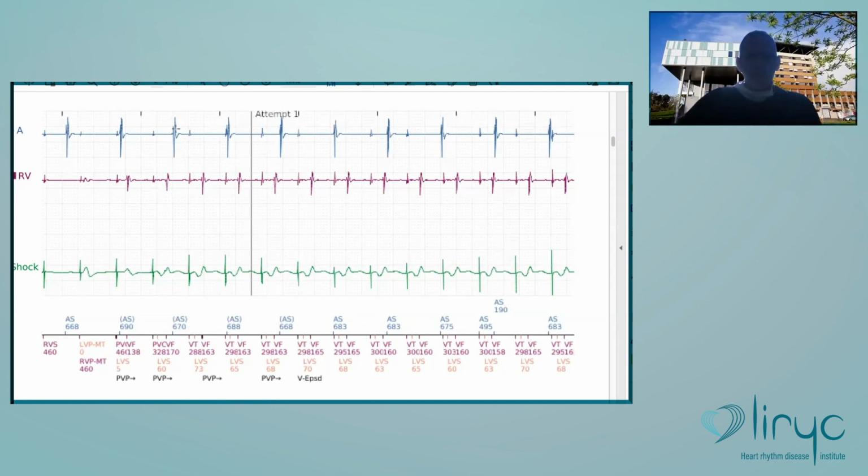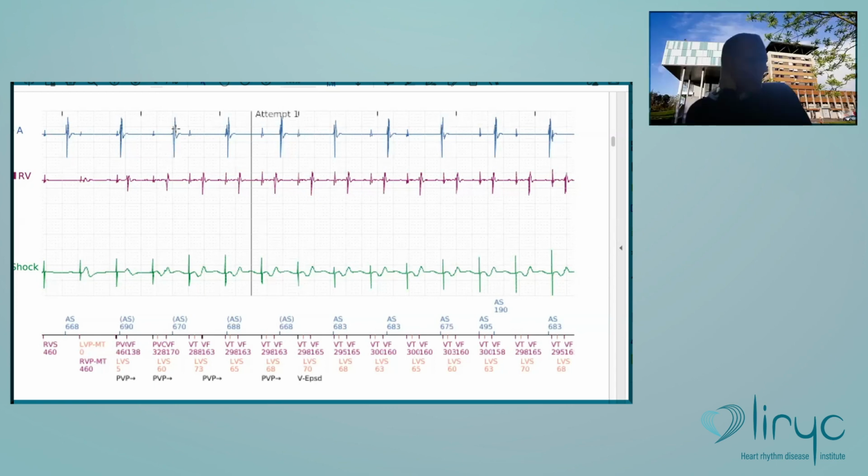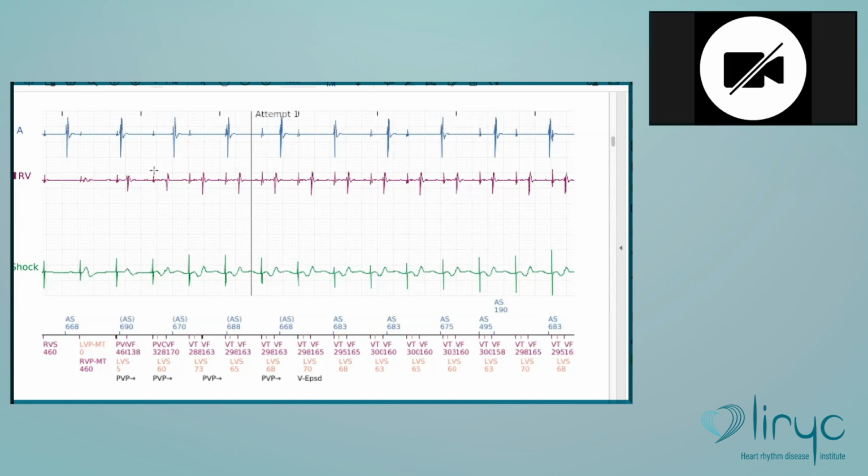Think about the largest supplier of your pacemaker implantations. The ones you always thank on Monday and on Friday. The TAVI guys. Yes, exactly. What do you think it could be? You know, for implantation of TAVI, at a certain time during the implantation, you will do rapid pacing. You see, external rapid pacing.